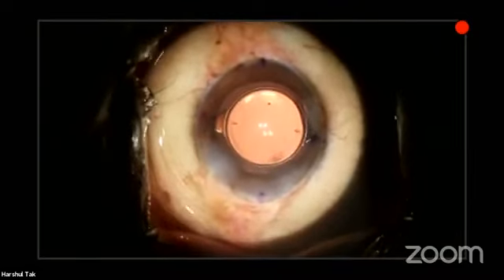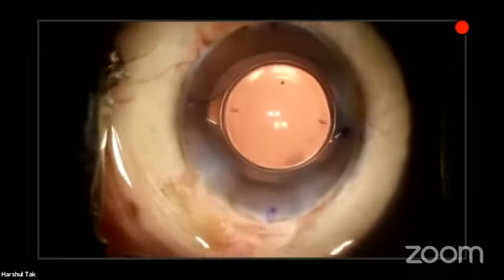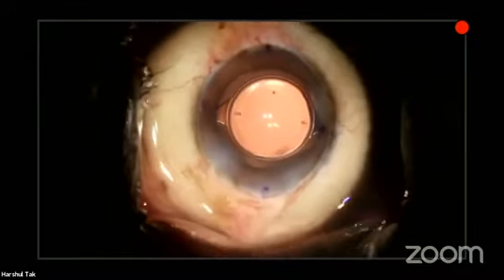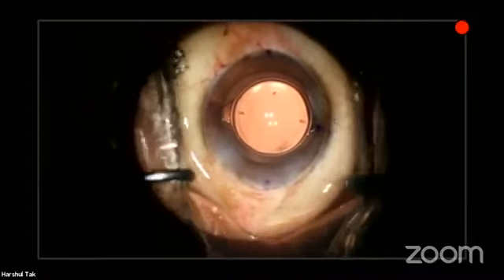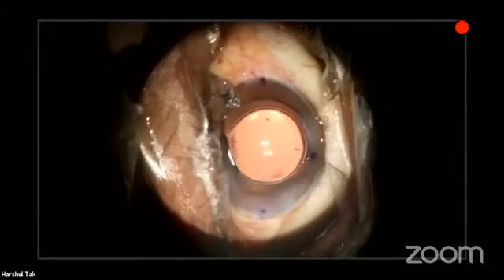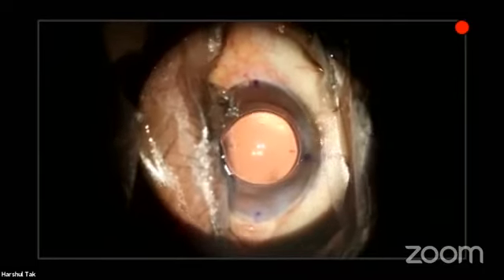Before taking off the speculum, make sure you zoom. Now see, the lens is well aligned. I think you all can appreciate that it's well aligned. The axis is overlapping nicely all around. So I zoom down, I take off the speculum, and see at the end of the surgery, after I take out my speculum, the IOL is well centered and it's not rotating. That's the way you should come out. Okay, bahut accha ho gaya na. So with this we come to the end of this surgery.